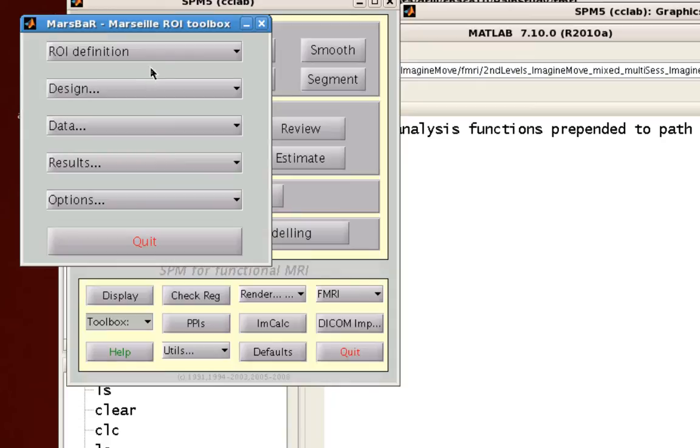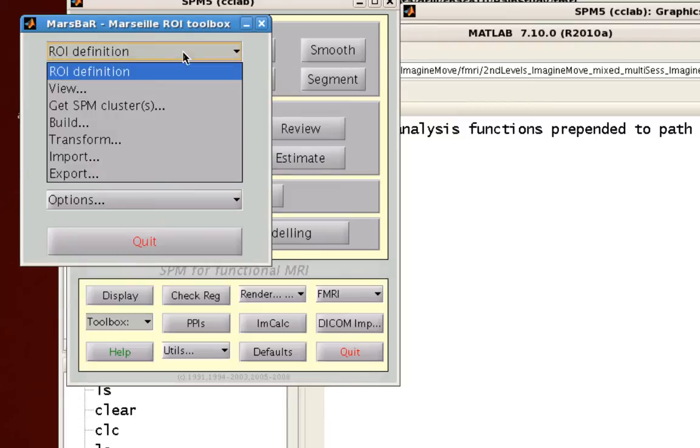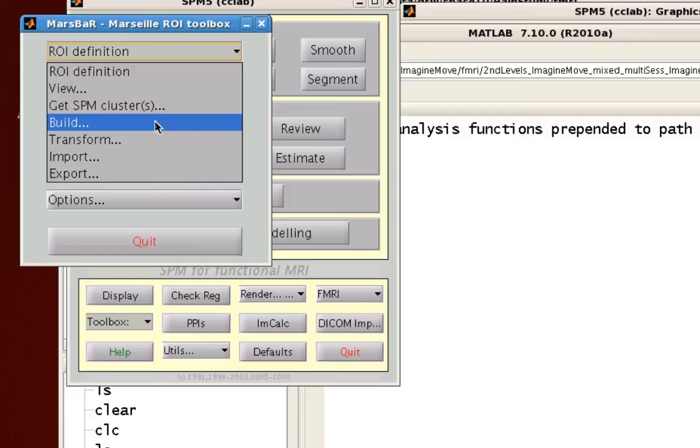Now we're going to focus only on this ROI definition drop-down menu right here for creating regions of interest. So within this, first of all, let's click on Build, which just creates an ROI from scratch.